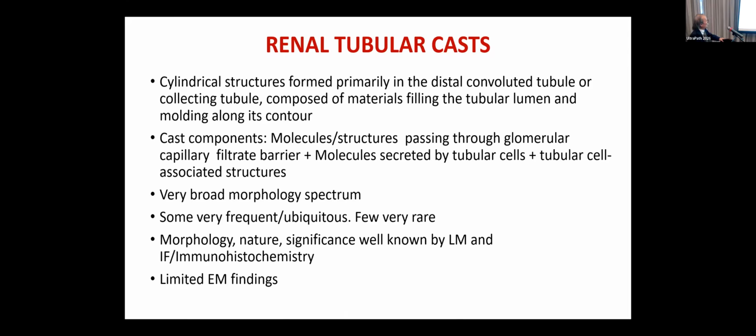Very broad morphological spectrum. Sometimes it's very frequent and quite ubiquitous. Some others are very rare. Now the morphology, the nature, and the significance of these casts are usually very well known by light microscopy and immunofluorescence. And there are very limited EM findings, probably because nobody needs to know the ultrastructural features of the tubular cast for either diagnostic or prognostic purpose. But then we need to know something about its ultrastructural pathology anyway.